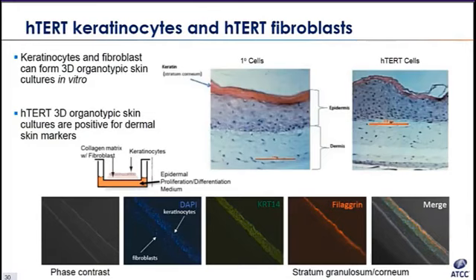This data demonstrates that the immortalized keratinocytes retain differentiation capability after an extended in vitro culture period beyond the capacity of normal primary keratinocytes. Thus, hTERT keratinocyte cells have significant value for a wide variety of investigations of human epithelial biology in a tissue physiologically relevant context.